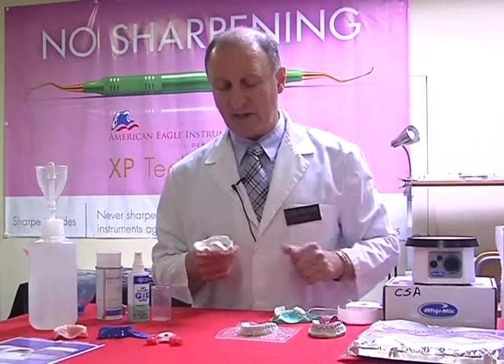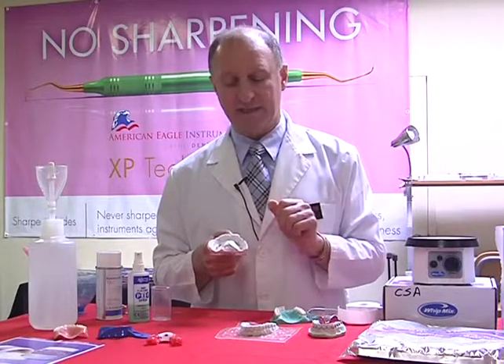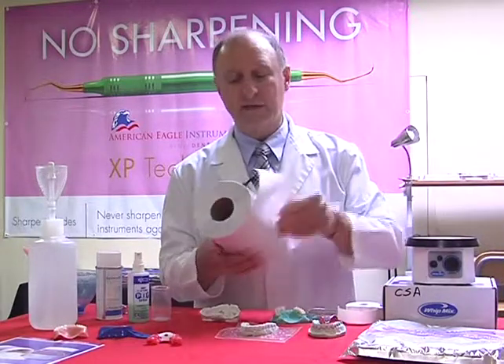And we've got a nice set. Now, once the material is set like this, we have an accuracy of 4 days. Now, in order to keep that accuracy, what most people would normally do is take hold of paper towels, Kleenex, etc.